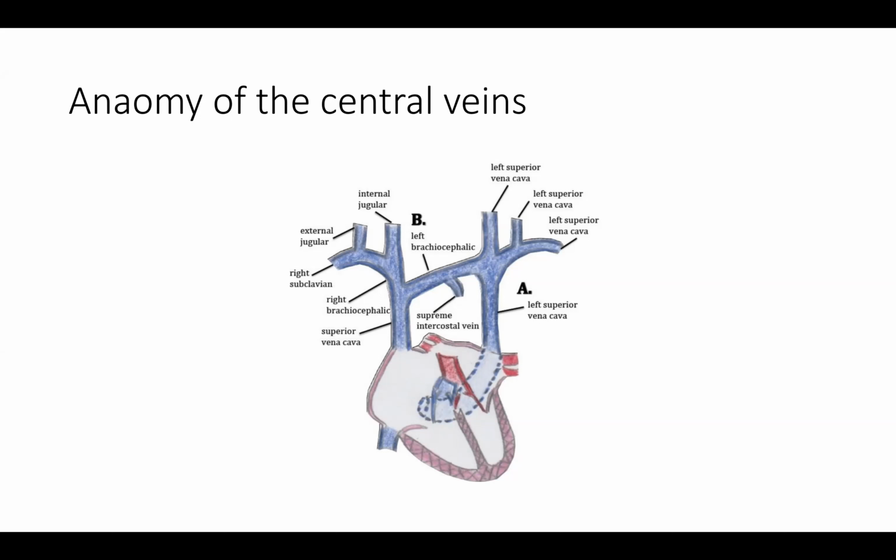And if either the right or the left shoulder is not working, you also have another access for transvenous implantation, using the transfemoral route and the lower abdomen. I've been privileged to be part of such an implant when I was in India.